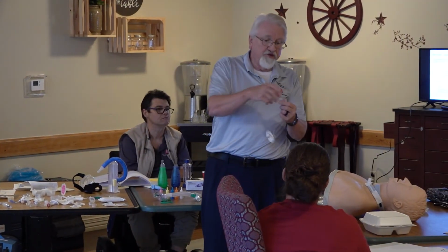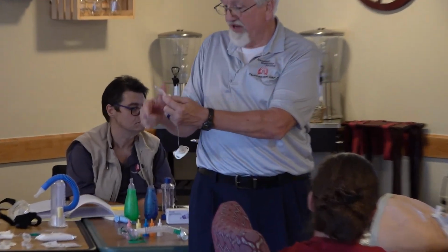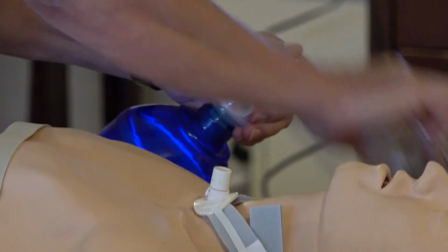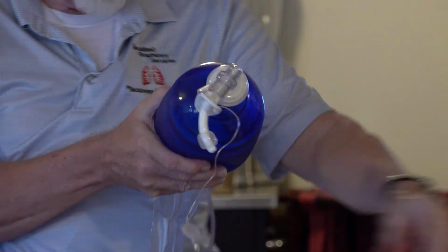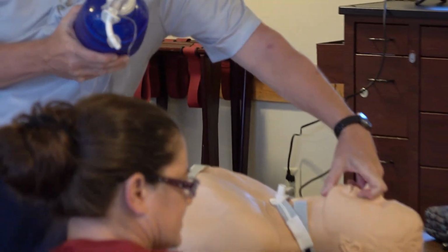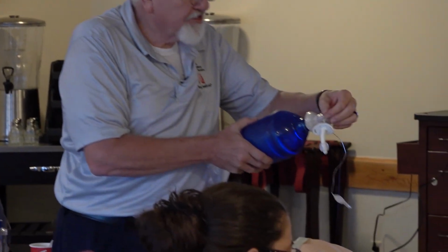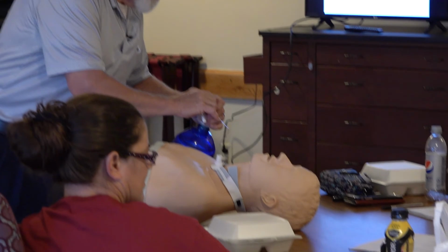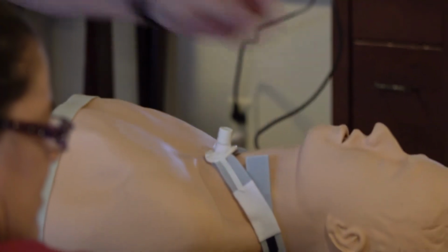If he has a cuff trach in, you're going to make sure the cuff is inflated, and you do that by feeling the pilot. If the pilot's inflated, his cuff's inflated. Okay? It's in there. I'm going to connect directly to the hub, and I'm going to give him his breath. Why? Because this is going directly into his lungs. It can't go anywhere else. I don't have to worry about closing the nose and the mouth. Is all that because of the cuff, right? Because of the cuff, correct. All this air that's going in is going straight to his lungs. Does all that make sense? Okay.